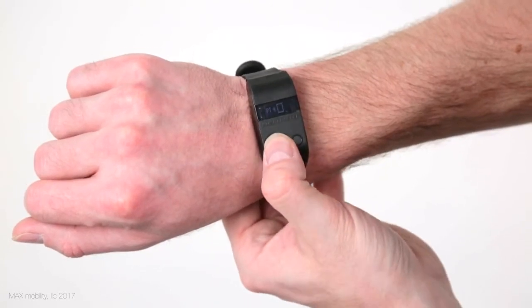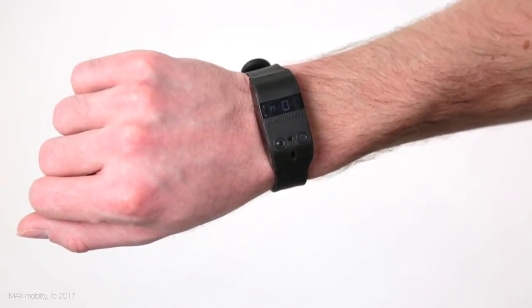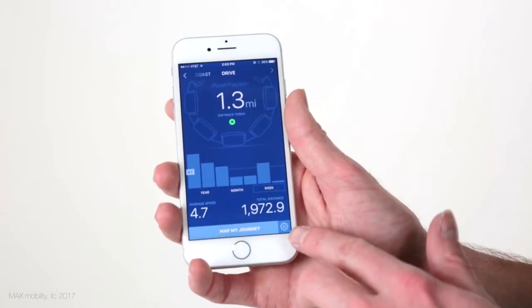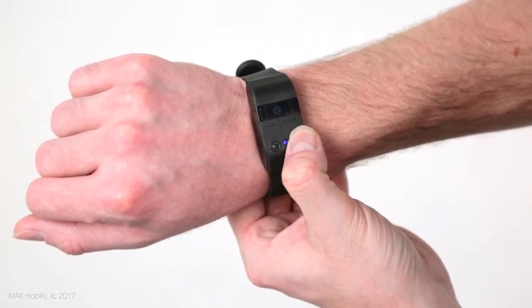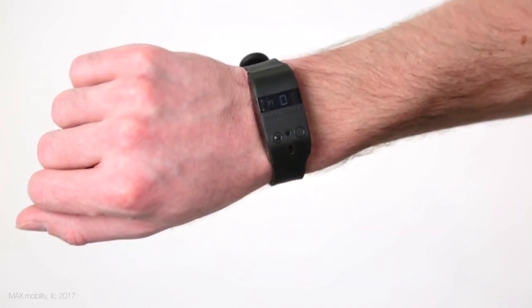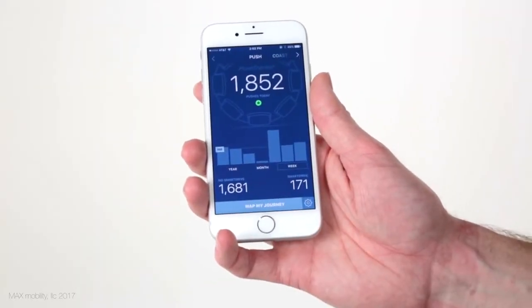Whenever you want to send PushTracker data to the app, connect the app to the PushTracker to modify SmartDrive settings, or for any other reason, you will need to initiate the Bluetooth connection from the PushTracker. Pressing and releasing the right app connection button on the PushTracker will activate the Bluetooth and connect it to the app for data exchange. The app also displays the status of your PushTracker Bluetooth connection.